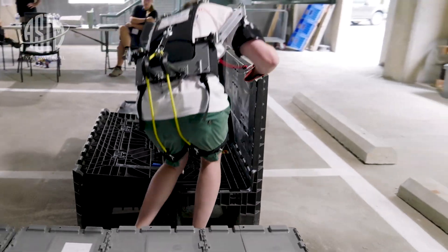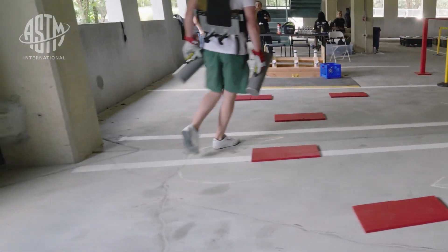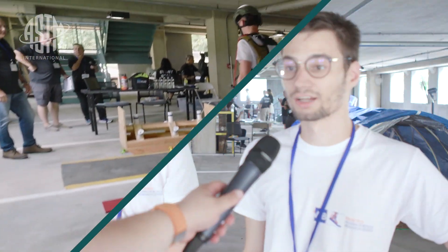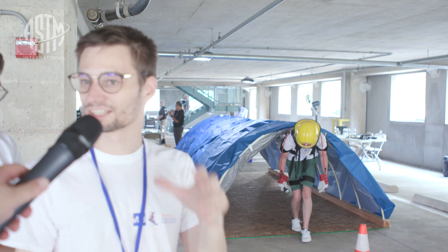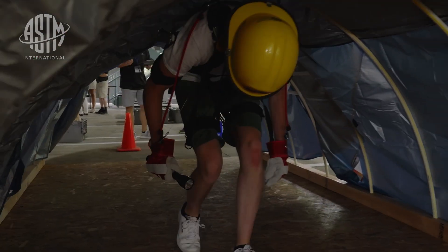We want to support three separate things. All the loads you're holding will go straight to your shoulders, relieving your arms. At the moment, he's crawling under a quite confined space. So basically, what we want the EXO to do now is support his back a little bit and make sure that he can keep that bent posture.